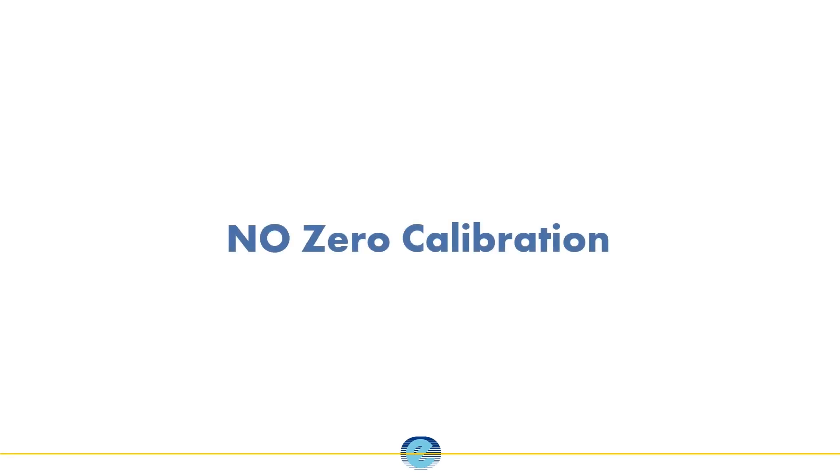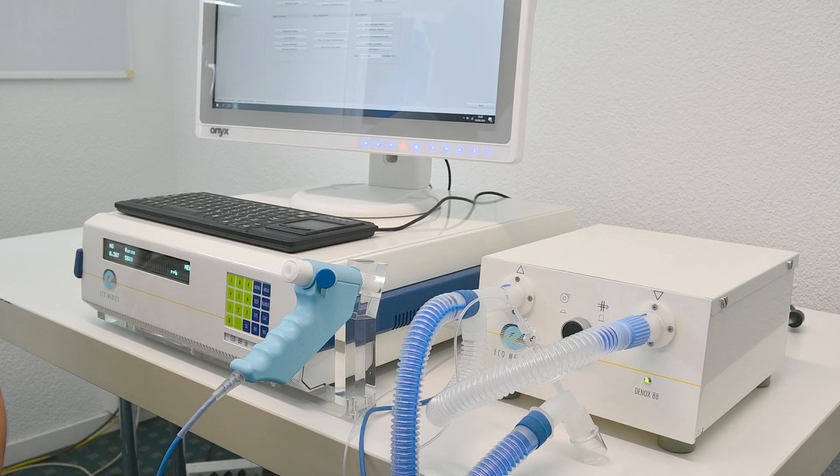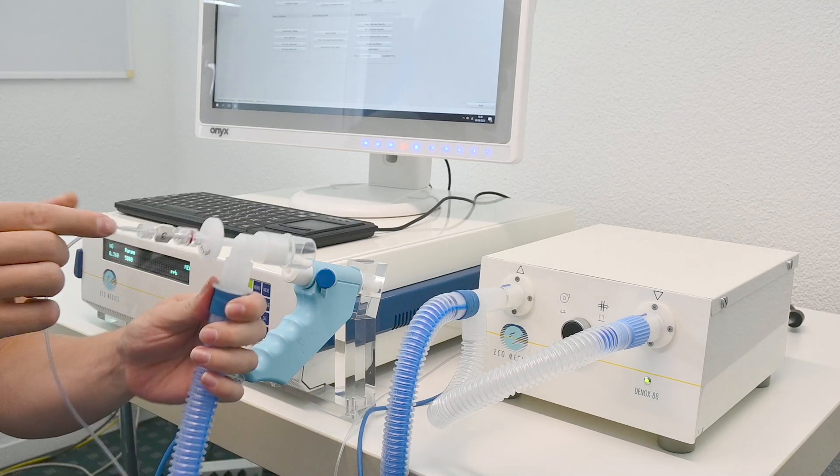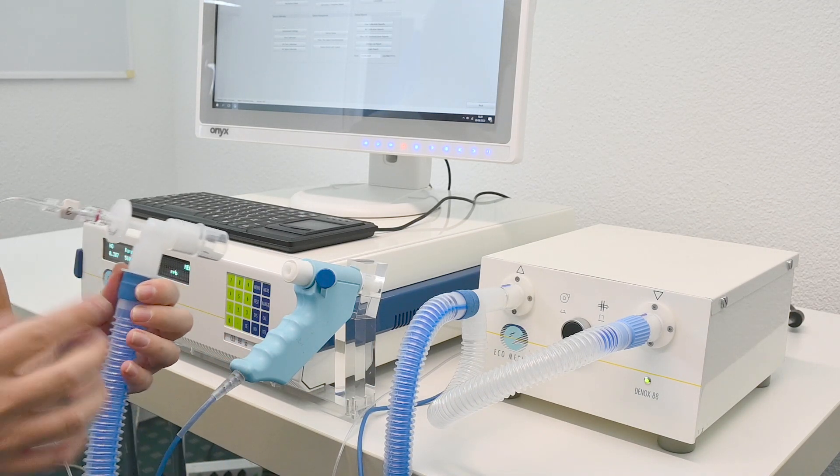The NO0 calibration procedure requires delivery of NO-free air from the DNOX to the sample tube. This is achieved by activating the blower mode of the DNOX module.